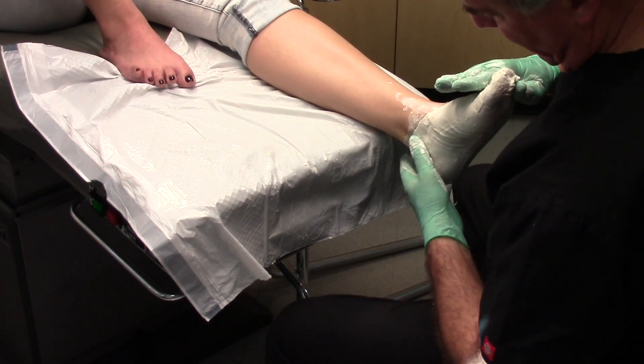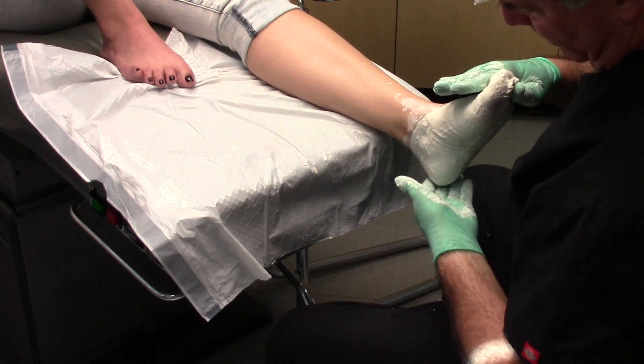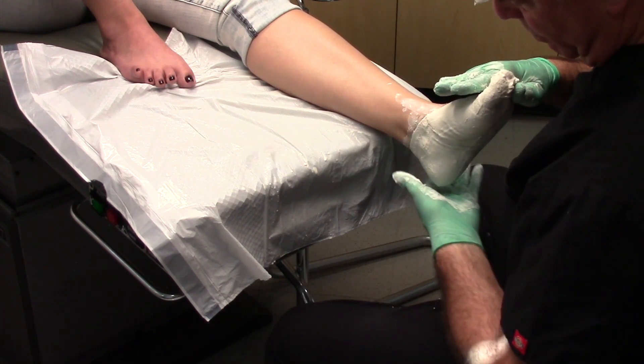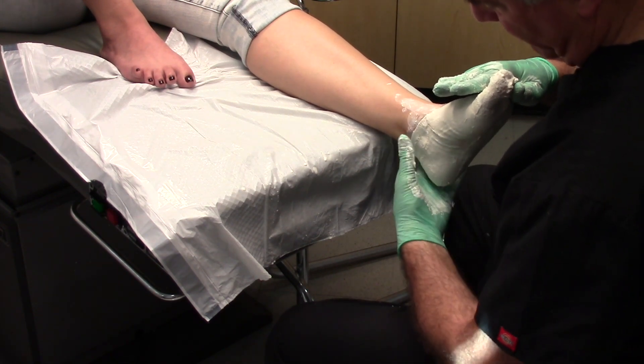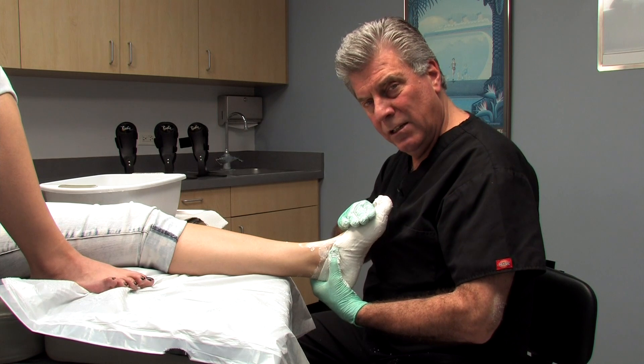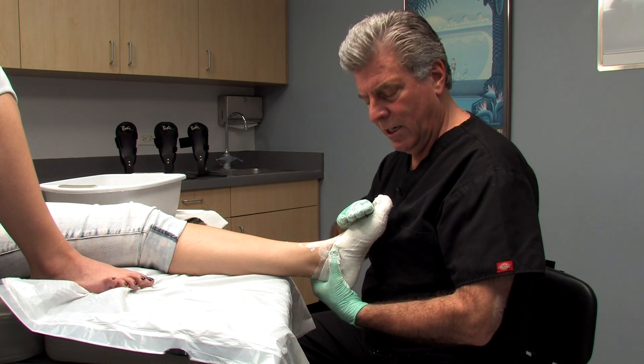Note there are no significant wrinkles or bunching. The heel of this cast has no redundant plaster — it's all been molded through the back of the cast and off the weight-bearing surface. This assures that the interior of the cast is smooth and captures the anatomy of the foot accurately.